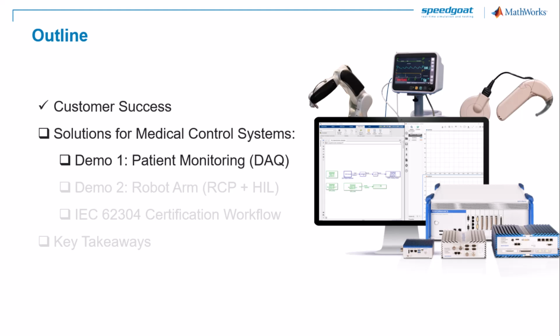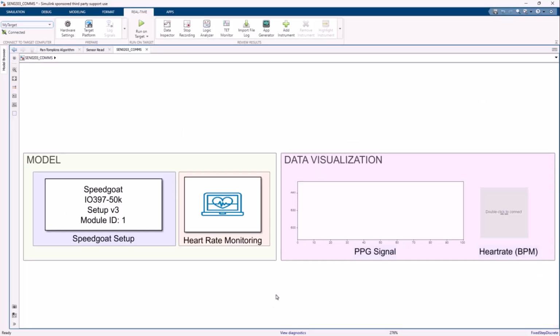Here I want to show you just how simple it is to get started with Simulink and Speedgoat for any biomedical application that requires reading and processing biosignals. So here is our Simulink canvas. We can organize the model and data visualization as follows, and this will really depend on your individual medical device use case, but for our heart rate monitor, we only need 3 parts.